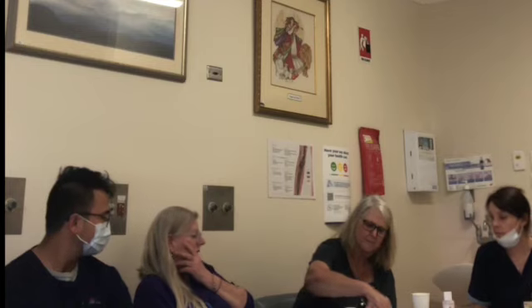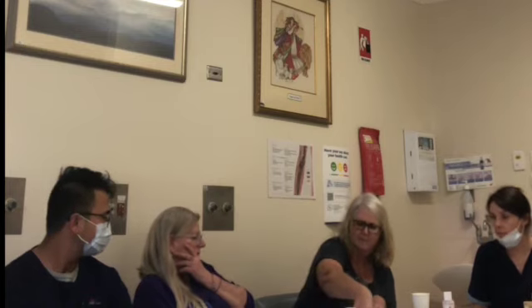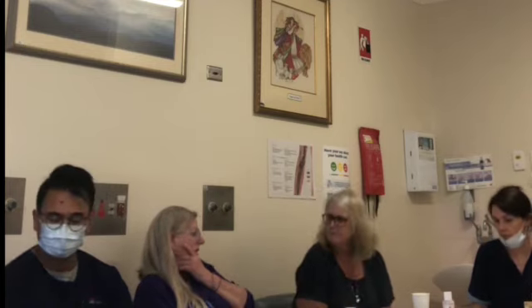Okay guys, what did you put in the 20 gauge section, Leanne? We had potassium and a CT. It could go with an 18. Yeah, it could. If you've got an 18, I definitely use it. Yeah. They say more than an arm.